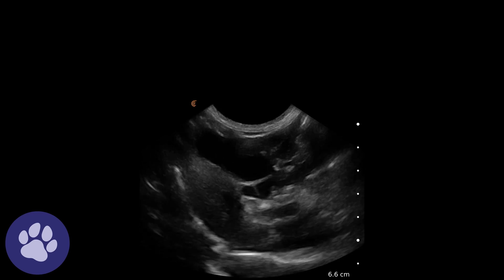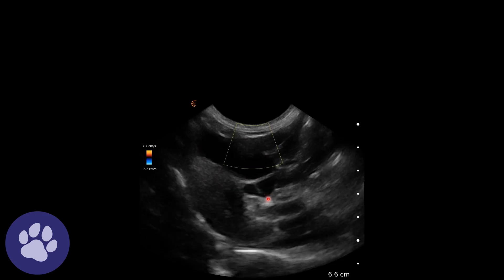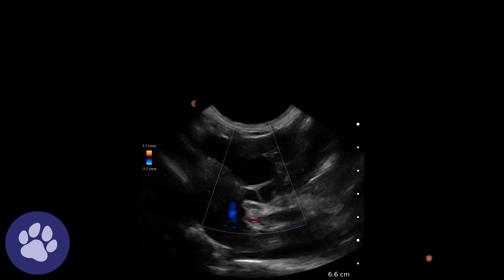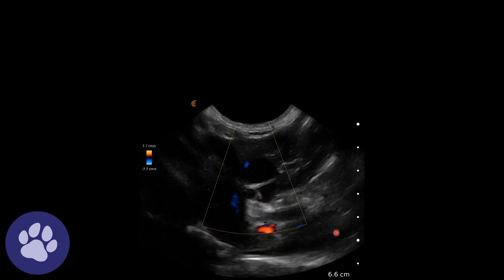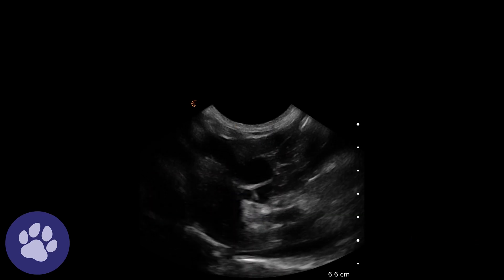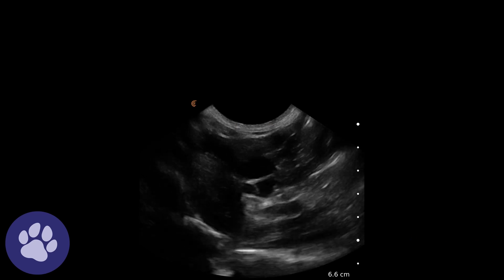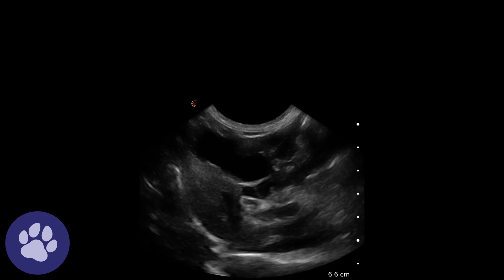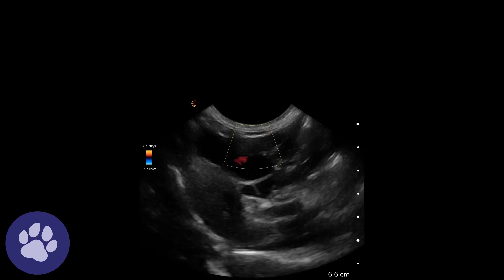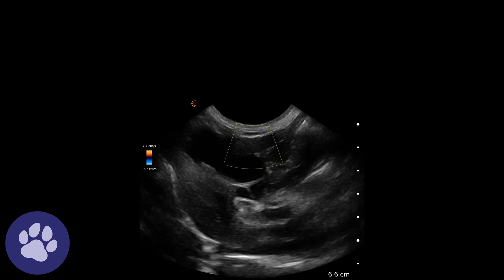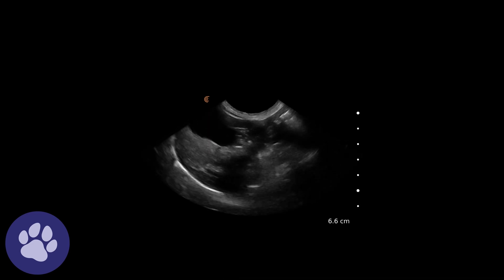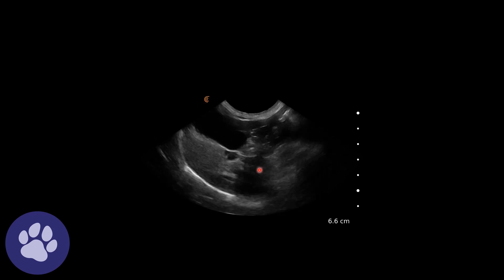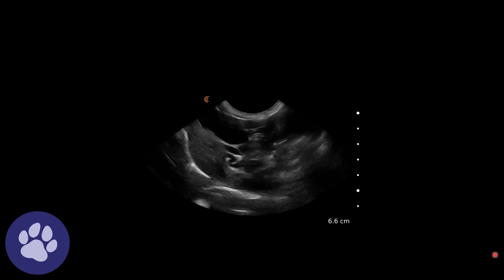Turning the cat over, we can now see the gallbladder from the right-hand side and assess these ducts. We're applying colour Doppler to see whether there's any flow in these, which there isn't, so that does appear to be tortuous bile ducts. That can be normal in cats, but combined with this irregular gallbladder wall makes us a little bit more suspicious of cholecystitis. We can see that gallbladder with these grape-like structures below it showing the tortuous bile duct.